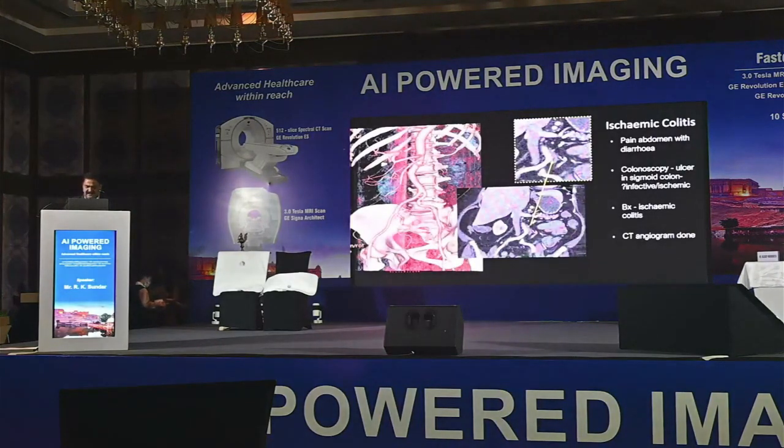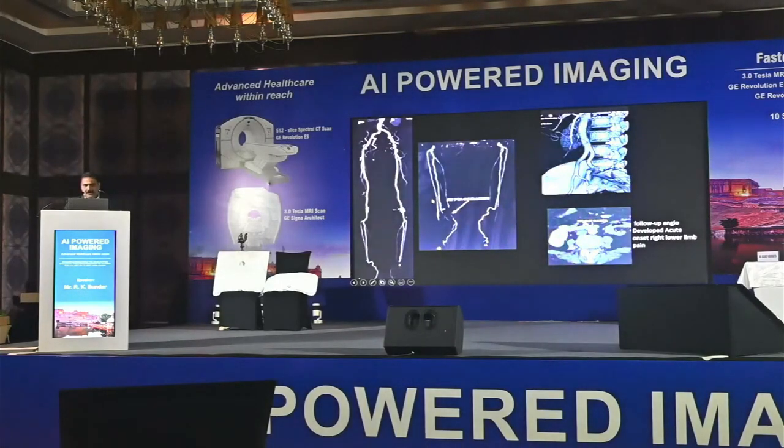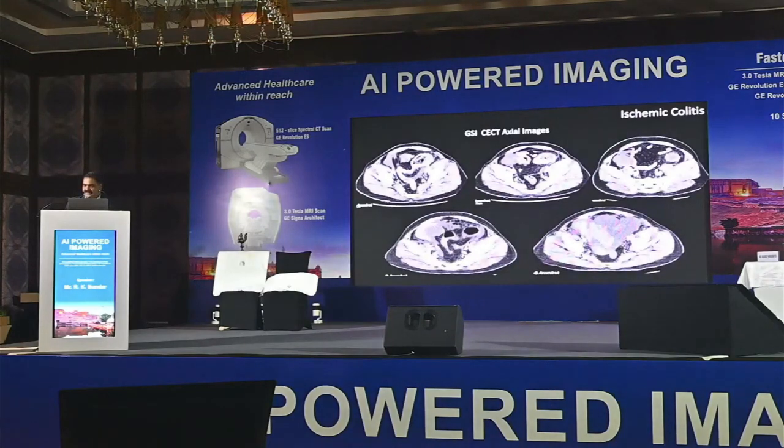This patient, an old-age person who came with ischemic colitis, diagnosed elsewhere, then we did a CT angio which shows the IMA thrombus, and then we went for bowel imaging with spectral, and you can see no enhancement of a large portion of the colonic wall. When we did a follow-up after 5 days, because she developed right leg pain, we were able to see a thrombus inside the aorta that was dislodged to the lower extremity. So the patient had a thrombus in the aorta which got dislodged. So we have made multiple diagnoses using spectral imaging there.